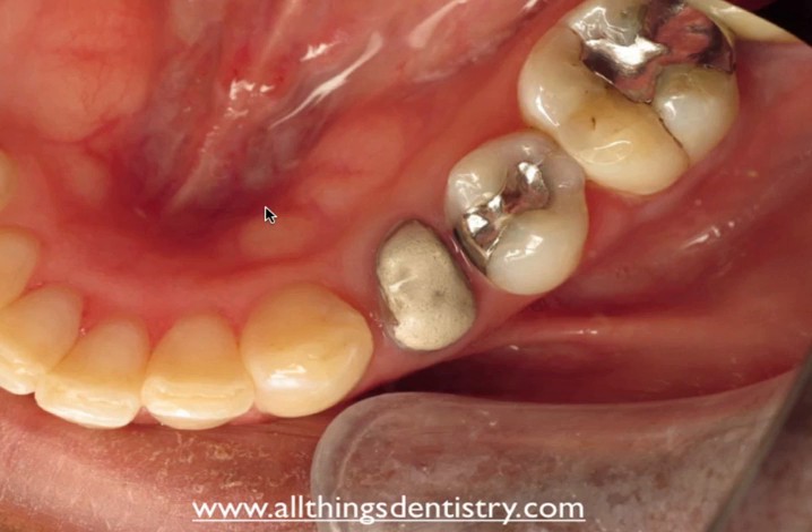The tori were small to medium on the left side, and maybe medium size on the right side. They were asymptomatic — it didn't even cross my mind to ask if they bothered her. But we were going to take that into consideration during our crown lengthening procedure to obtain the proper contouring. I'd never come across a patient where I had to do crown lengthening with mandibular tori, so this was a new learning experience for me.